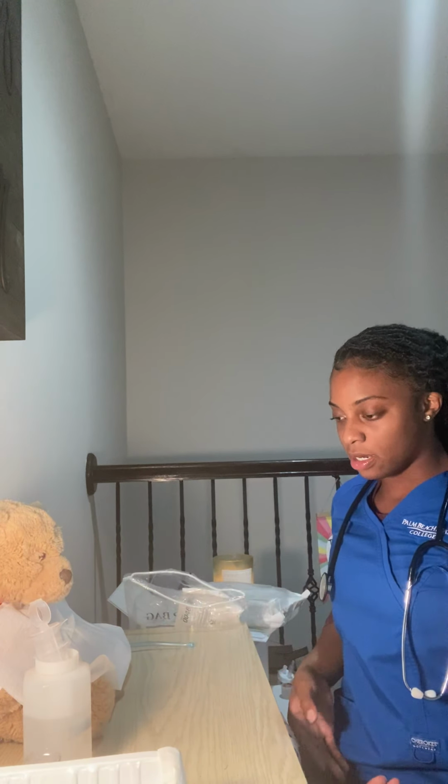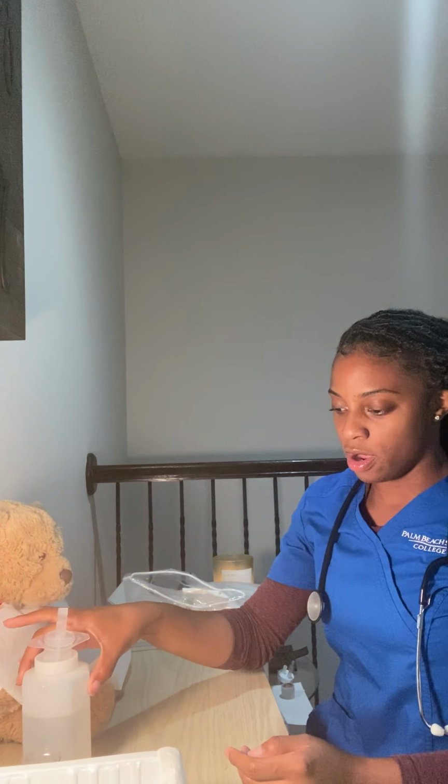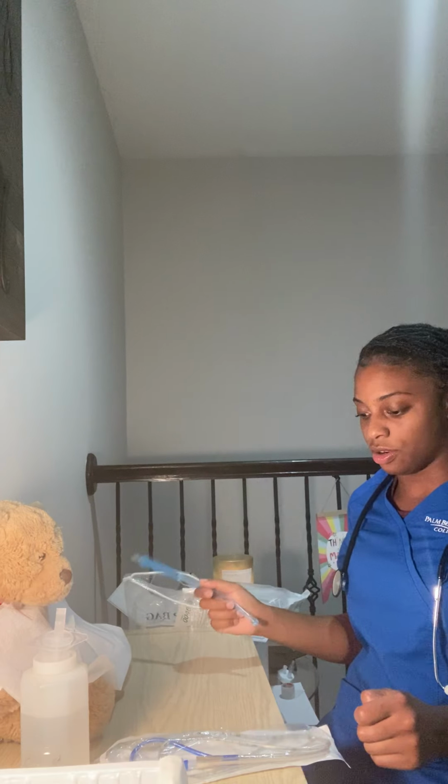I've got my tape set up here. I've got my syringe and my water. I've got my pH paper. I've got a glass of water for my patient to have. I've got my basin. I've obviously got my catheter, and then I've got my suction that's connected to wall suction already.